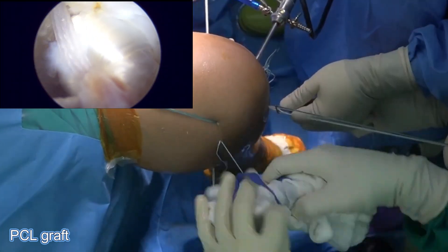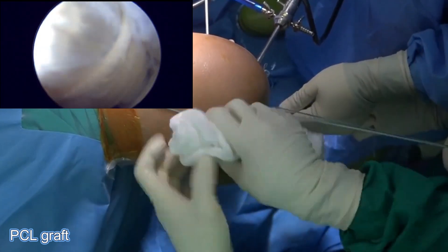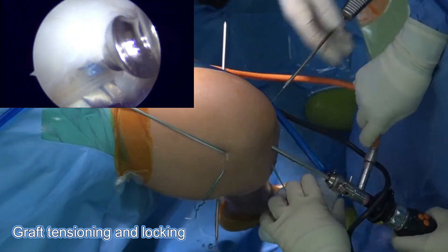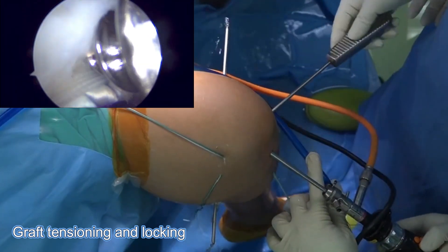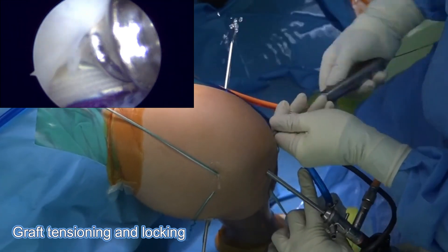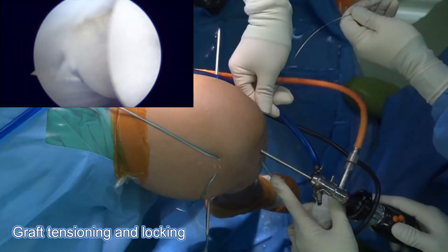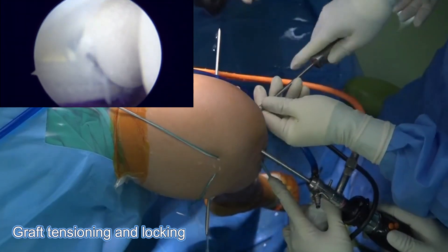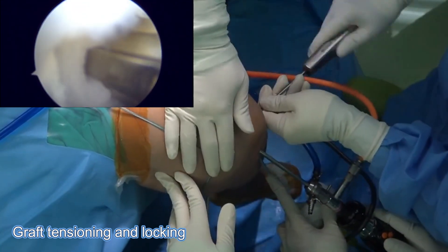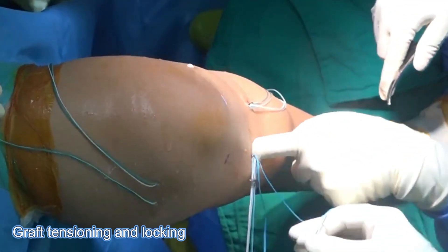Similarly, with the femoral portion of the graft as it is in the metaphyseal area. A bioabsorbable screw is placed in the posterior superior portion of the tunnel in order to push the graft anteriorly. The tibial portions of the grafts are tightened with a button.